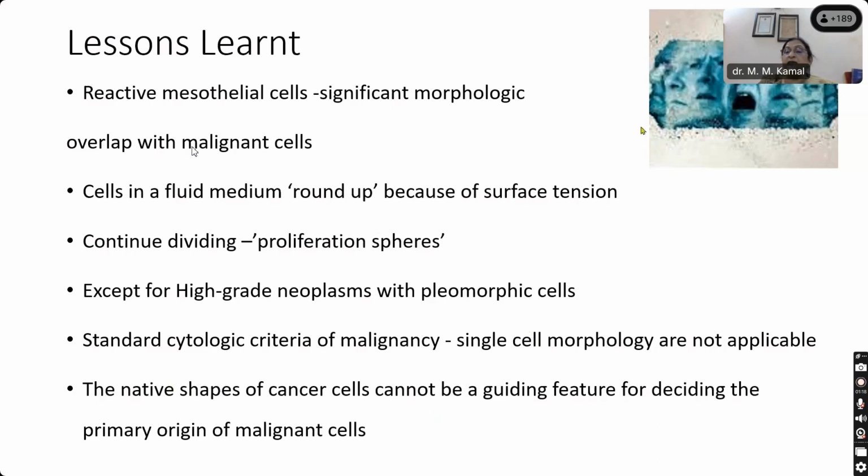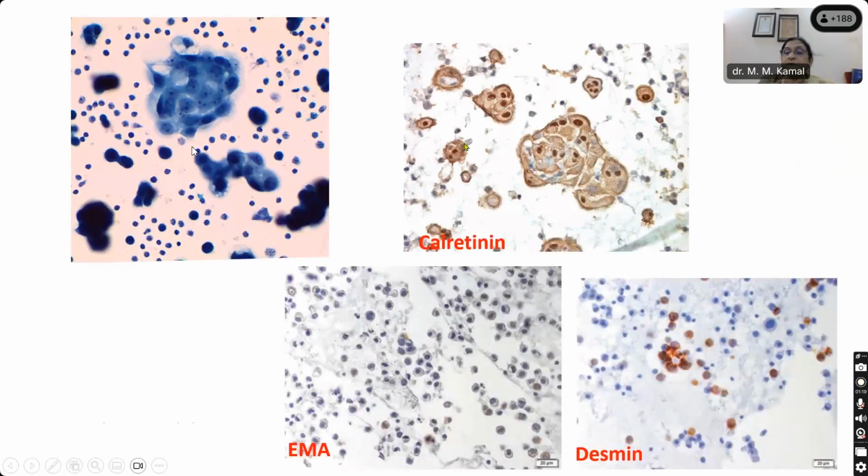So as we said, the reactive mesothelial cells will have many faces. Some are very quiet, cool, and some are very bad, which are frightening, and therefore we have to be very cautious when we have to deal with such cells. Dr. Bharadwaj, any comment? Ma'am, I'm also for reactive mesothelial cells only with mild atypia. I don't think they are really malignant cells.